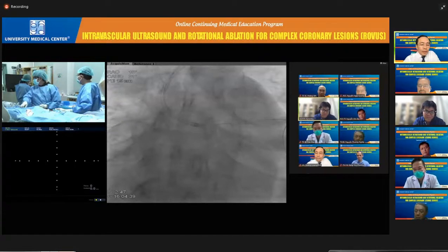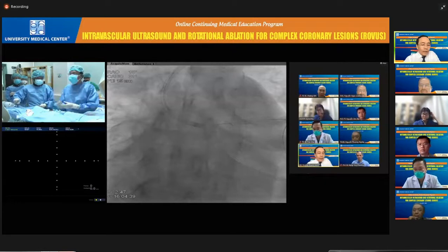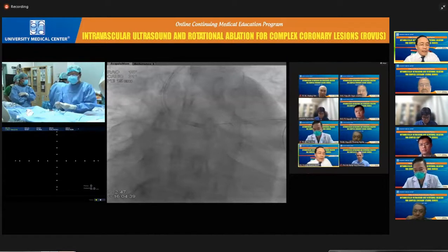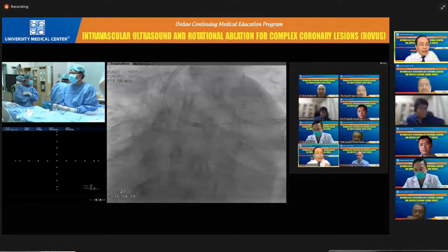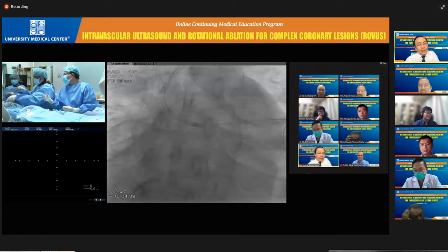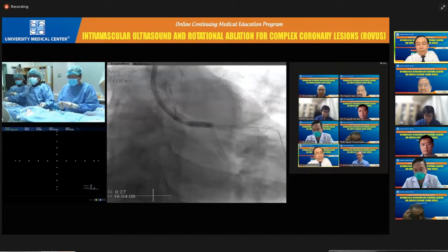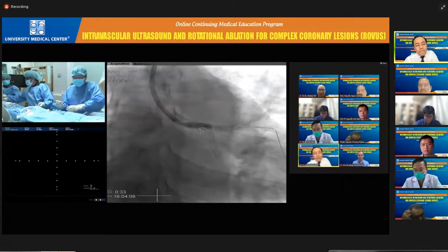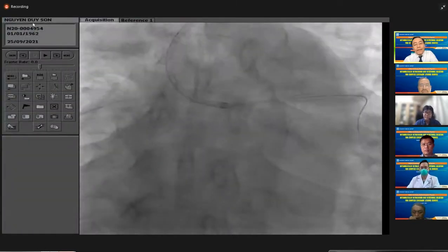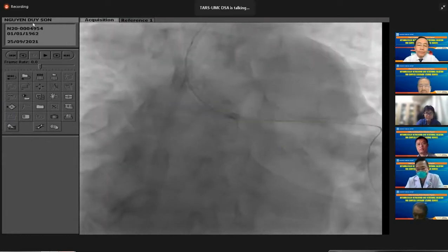So, Dr. Nguyễn Ngọc Quang said that we do POT before we do IVUS again, and Dr. Kuramisu said that maybe we can do the IVUS first and then POT later. But I think that it depends on the situation. In this situation, I think I will do both before we do IVUS, for the safety of the patient. So now we rewire the circumflex before we do IVUS and kissing.